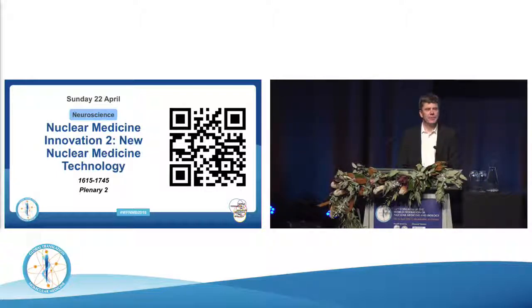It's really fascinating. I have one question, and you actually talked about this at the end. When we reconstruct the data, and especially with your Explorer, the acceptance angle, we are still kind of tied to sinograms when you do the reconstruction. Is there a better way to do this than always coming back to sinograms and having a very limited acceptance angle, because you have to spread it out and combine the coincidences?